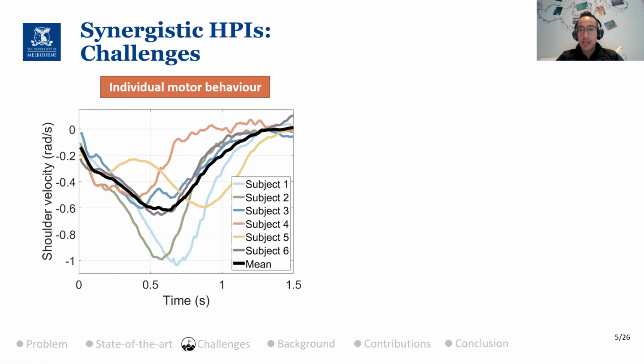And since you're training these systems with able-bodied people, why can't you do it with a person with limb difference, an amputee or prosthetic user? They no longer have that part of the limb, right? So it would be very difficult to get them to do the movements that you require to train the system.